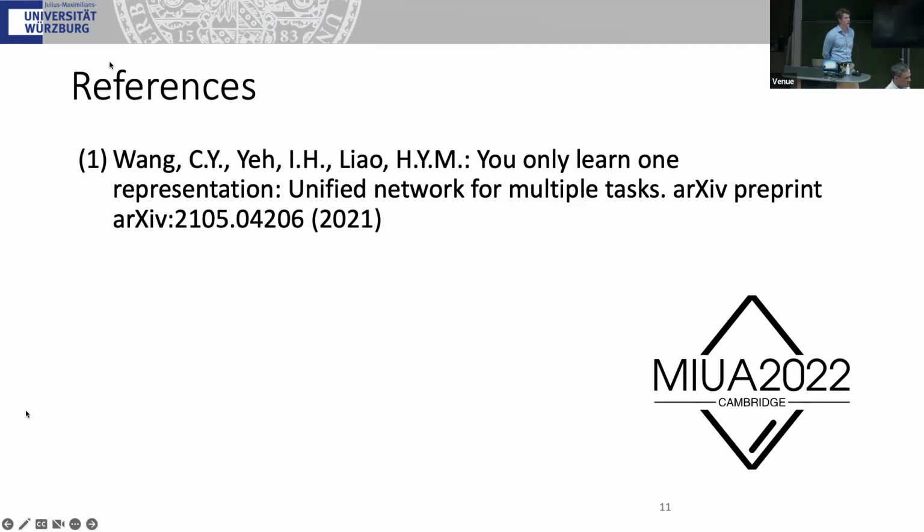Yeah, exactly. So we've done a little bit about that too. It's also written in the paper. In the paper, afterwards, once the whole examination is done, we take the widescreen classic image and do detections and annotations on that one. And then we have the side cameras too. We see how many polyps are missed by the front camera and how many are seen on the side cameras. So you're totally right. That's exactly what you should do.